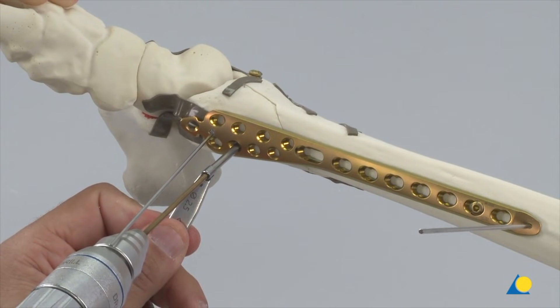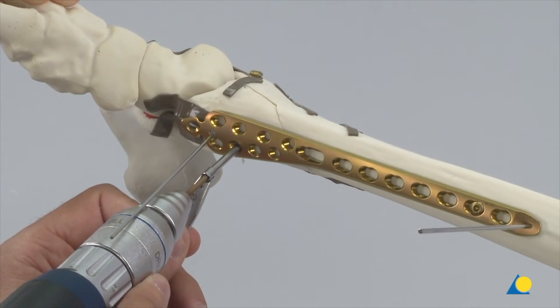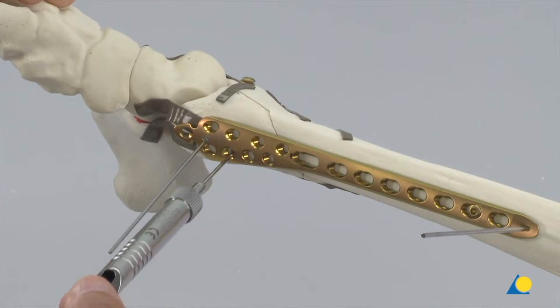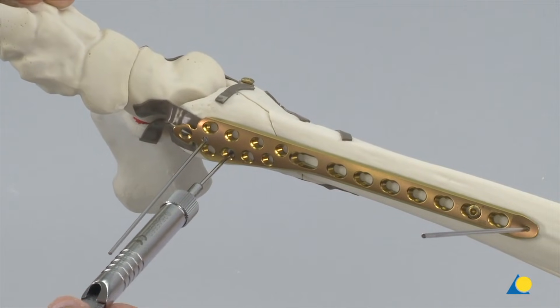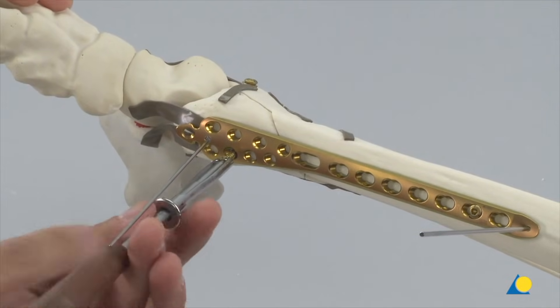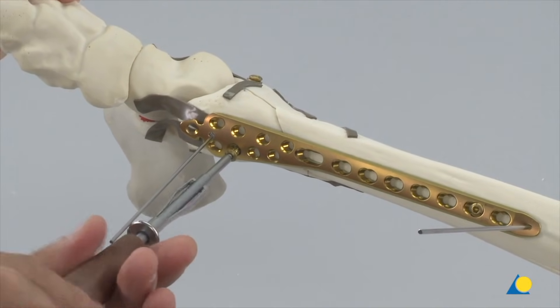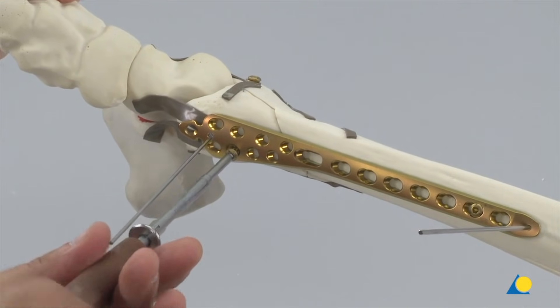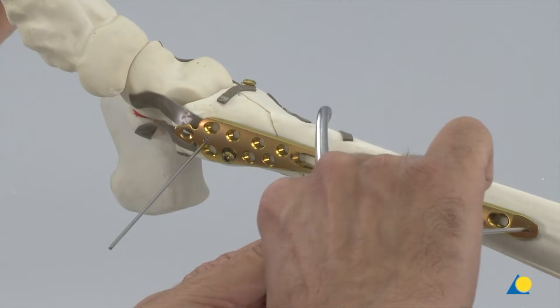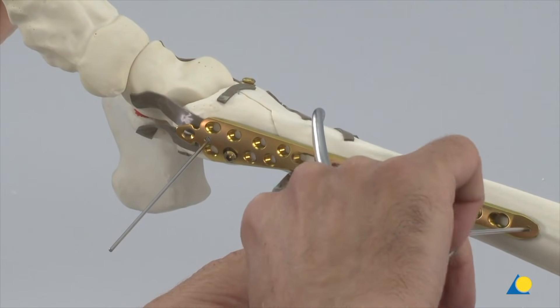Here it can be seen that the LCP is being used indirectly as a reduction tool to reduce the fracture. The alignment and angulation of the distal fragment are optimized and secured using a cortex screw, which can be replaced with a locking screw after the subsequent locking screws have been inserted. If the fracture becomes displaced, a pointed clamp is used to attain the required reduction before tightening the screw.